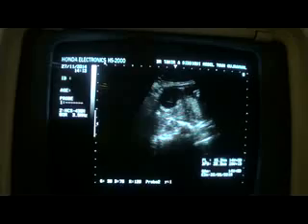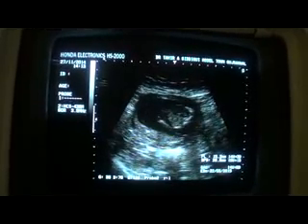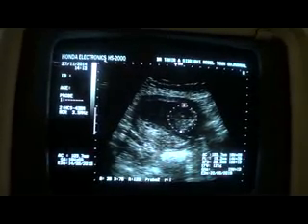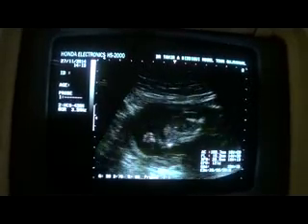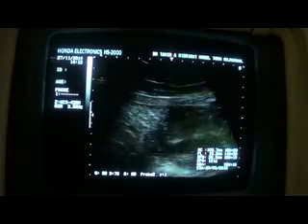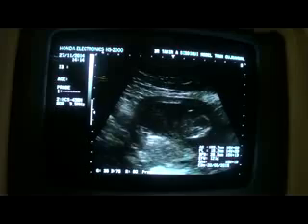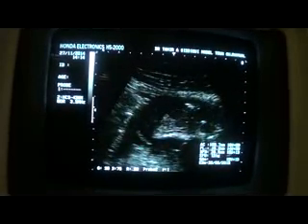Now, this is the transverse of the abdomen, and the abdominal circumference, if we can get it, corresponds. No, this is not the correct measurement. Just wait, let's magnify a bit and get the abdomen from the region of the portal vein or the stomach bubble, and then give a sweep to the probe. Going to do it again.